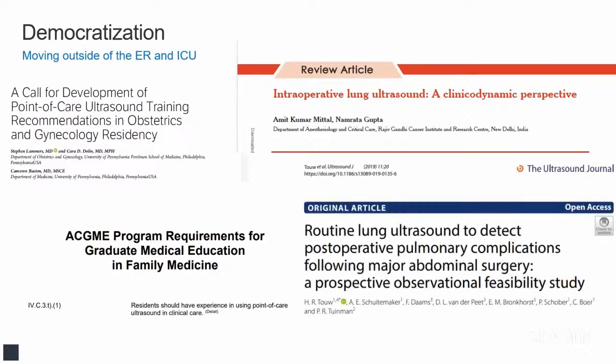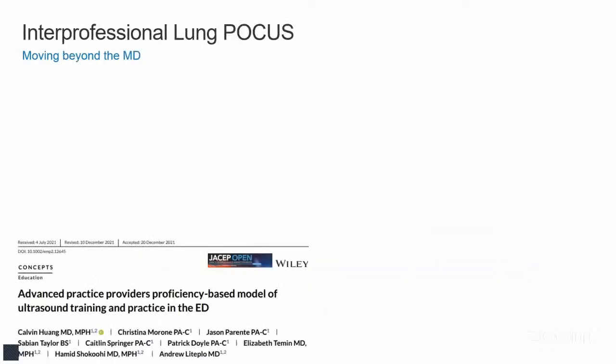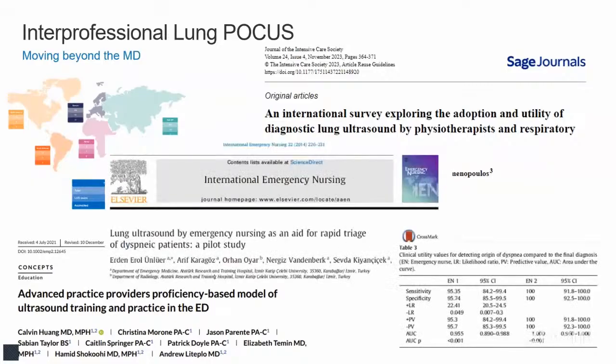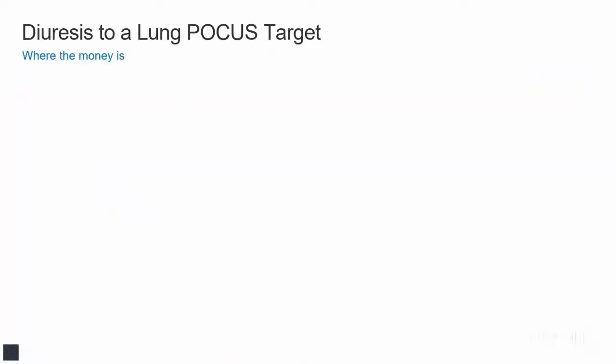And then afterwards, you can look at their lung ultrasound findings to see whether you can predict who's going to have a more complex postoperative course. Not just limiting this to the area of the intensive care unit, we can think about not just limiting it to physician scanners. We can see that APPs are starting to do this, and respiratory therapists globally have started to be involved in research on the applications of lung ultrasound performed by RTs. Nurses have been using lung ultrasound in order to make diagnoses of pneumonia in dyspneic patients and to help with triage in the ER.